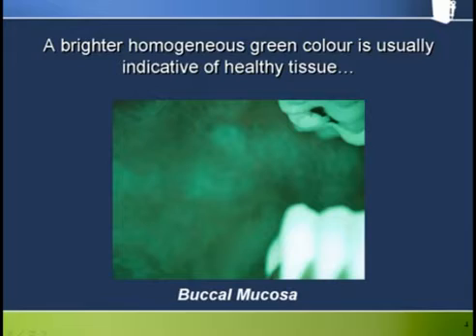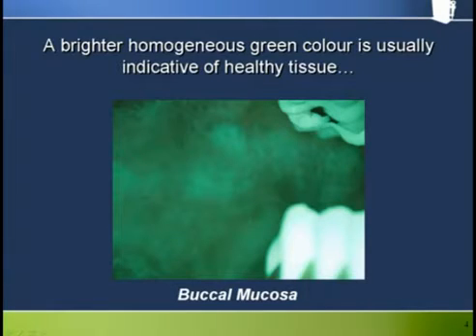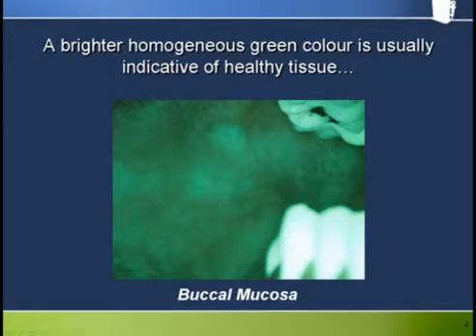Here we see the buccal mucosa with the highly fluorescing teeth on the right of the picture. The buccal mucosa is also typically green but is also a high risk site for trauma and consequent inflammation. It is quite typical to see at least some little patches of darkness, as we see in this picture at the back, which shows some mild trauma and inflammation with a resultant dark patch through the Velscope.